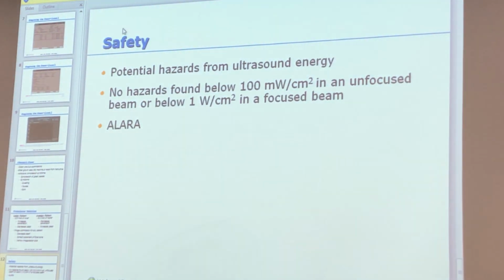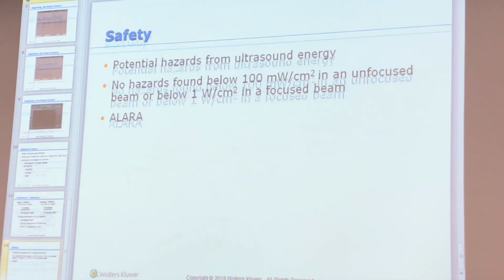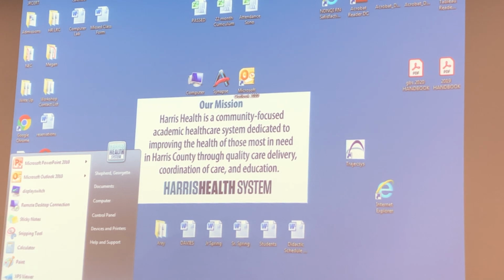Okay, so we're going to review this a couple more days because we're going to go over some of these. Oh, I guess I left it in my other room. What time is this class over? 10? Okay. So any questions on what you have to do for an OB scan? Okay. So let's go over some protocols.